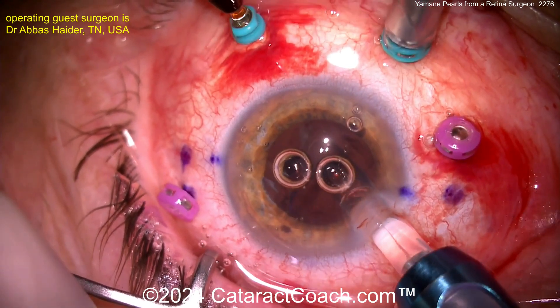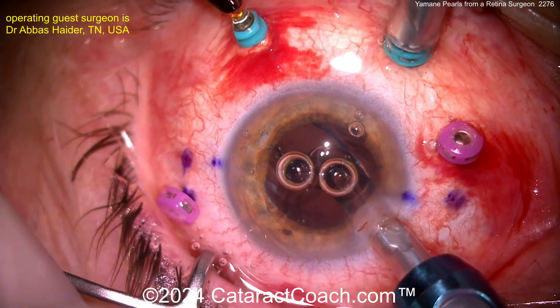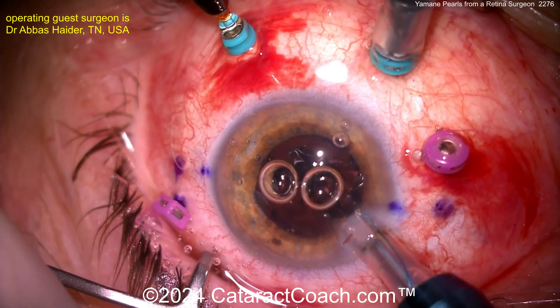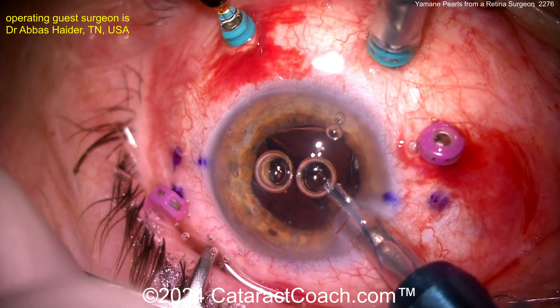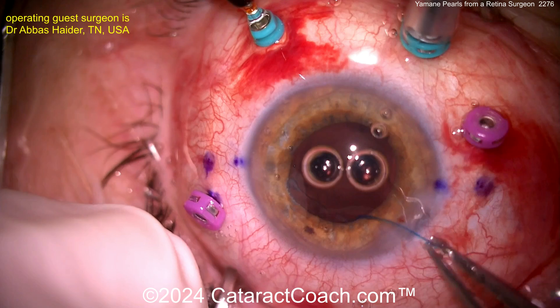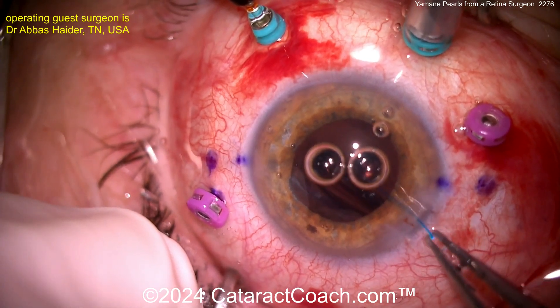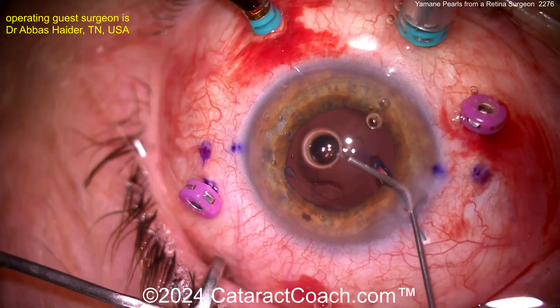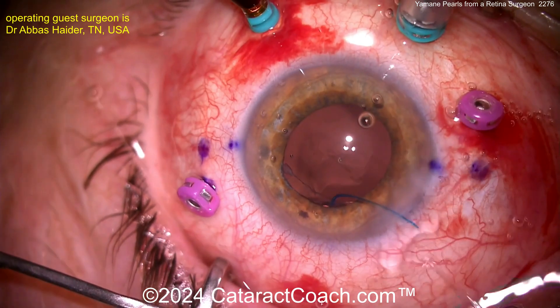Here it goes, coming inside the eye. He's injecting it inside the eye, leaving the one haptic outside the eye. The haptic can dangle in the mid vitreous because a complete pars plana vitrectomy has already been done here. Keeping the one haptic outside the eye so it doesn't fall back.